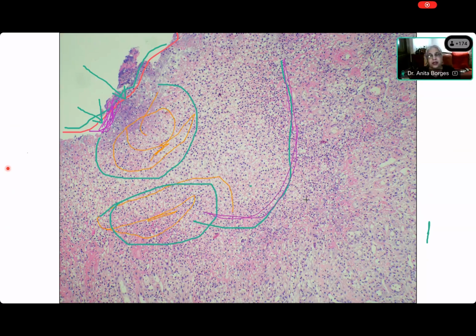So you've done exactly where somebody has scored, that is ulcer. Yes, ma'am. You've done it there, right? Okay. Okay, Chandana. Do you agree with any one of these? Ma'am, can I try? Ooh, now Vipali suddenly wants to come back again. No, wait 1 minute. Please let Chandana do it.